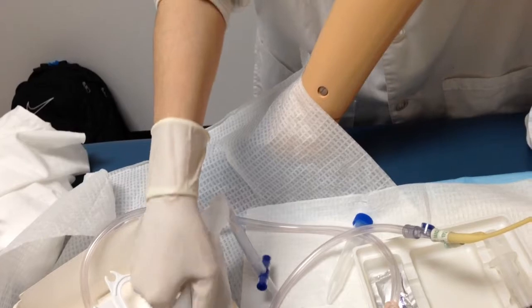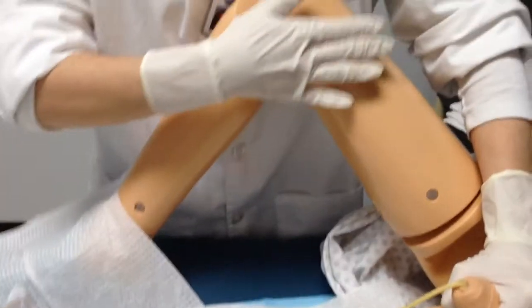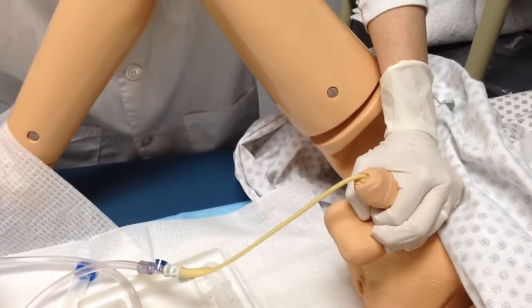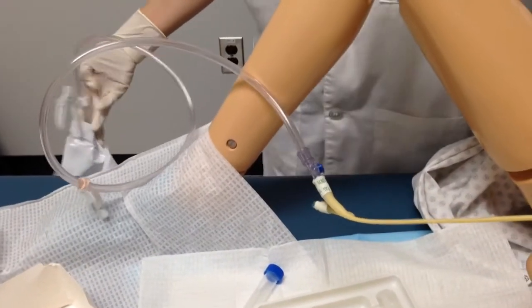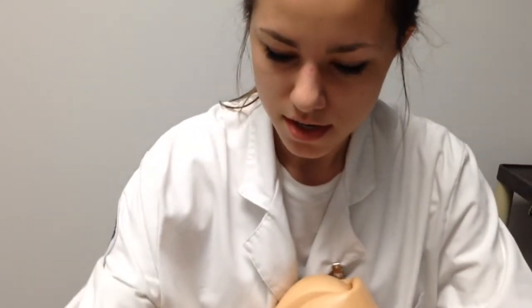And then I can take the catheter bag. I'd take the edge of it with a little bit of lag, place it on his stat lock on his thigh just to ensure that there's a little bit of lag so it doesn't get removed by tugging or anything. And then the actual bag would be placed on the bed, not the bed rail, hanging below the bladder. And what I'm going to be doing after this is checking the contents of the bag, looking at the urine to check for the color, the consistency, and the odor.